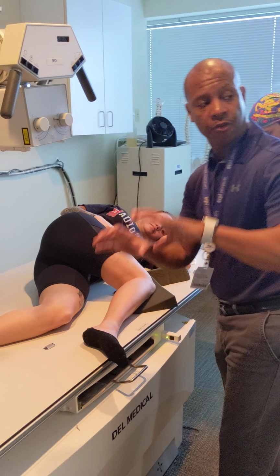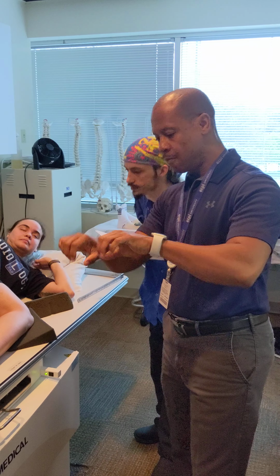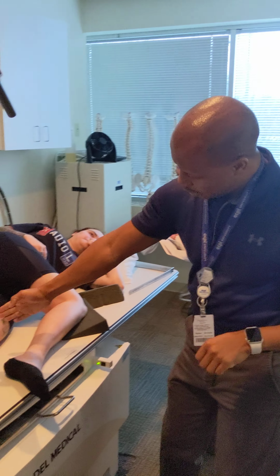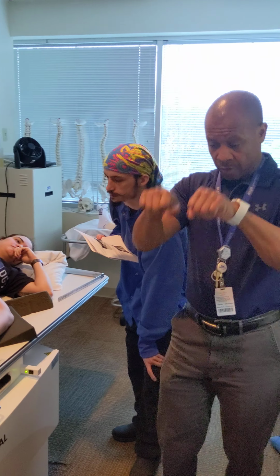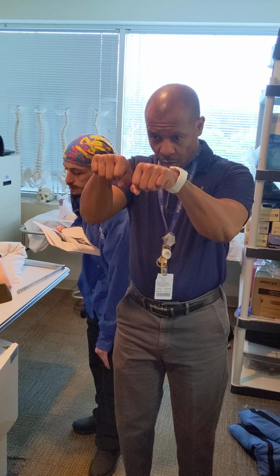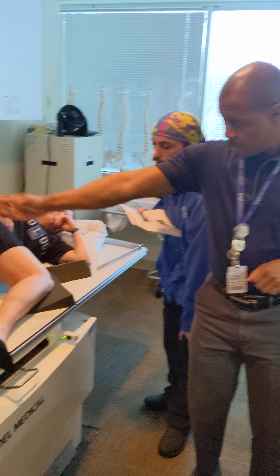Now, the condyles are those 2 big knot bones on the femur. The objective is when you angle this, you're able to see these 2 things side by side. Reason being, when a person stands, one is slightly lower than the other. That's why we have to come in and angle.